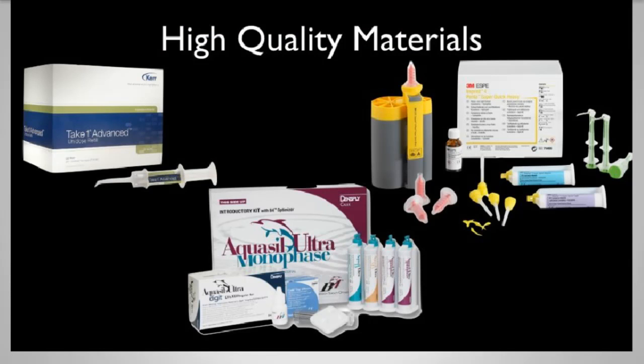After soft tissue management is done, we have to think about the materials that we're using. And we must control the application of this impression material. Thankfully, all top-tier impression materials today are pretty darn good. And the three depicted here, they're all excellent. In my opinion, technique is what's most important. However, we must keep in mind that if you have great technique and poor materials, they can come back to bite you. Great technique with excellent materials, you have the best of both worlds.